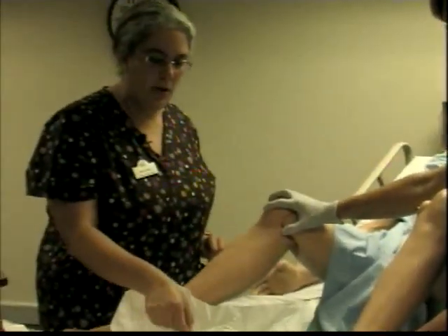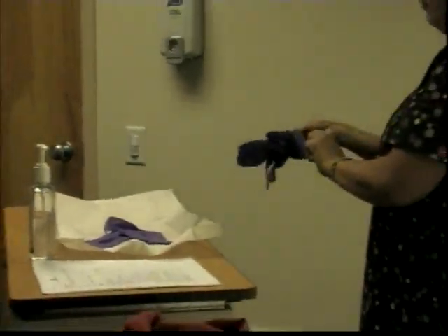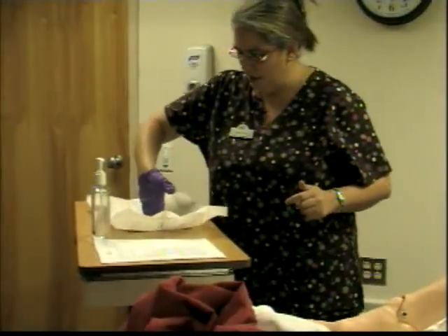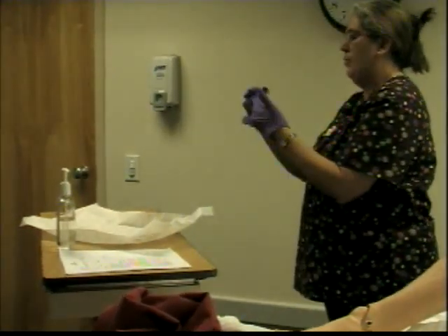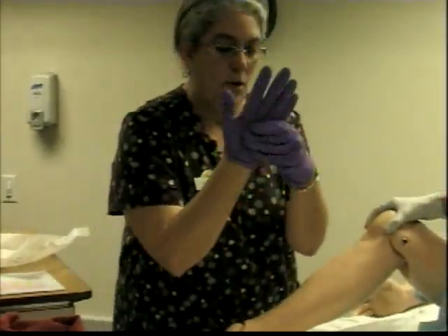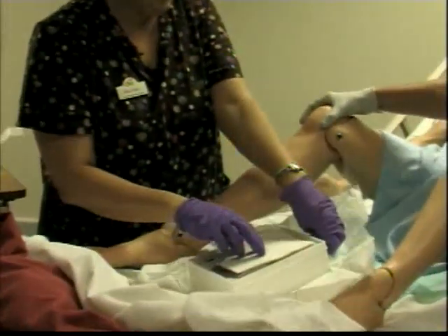Now take your sterile gloves and put them on. Make sure that your thumb is hitchhiking. Once you put them on, you can fix them. Now I'm going to ask my assistant to go ahead and expose the client.